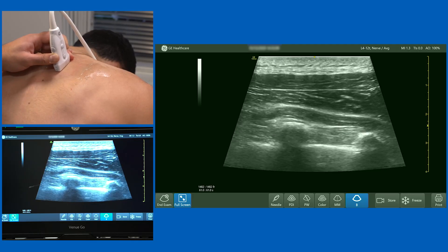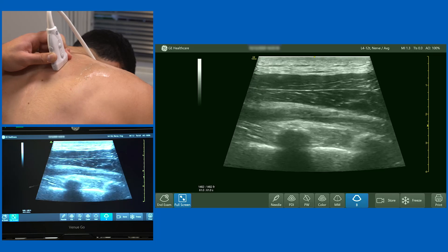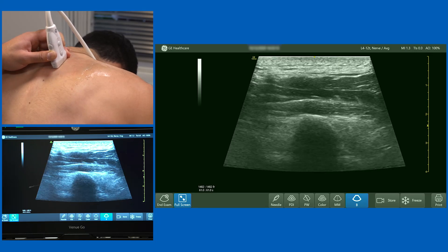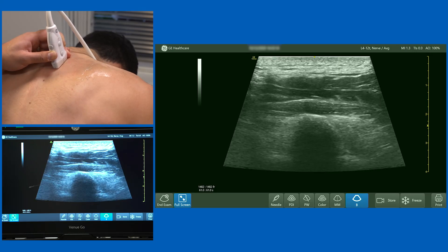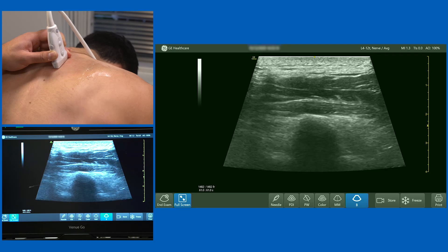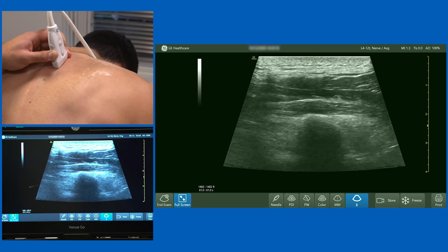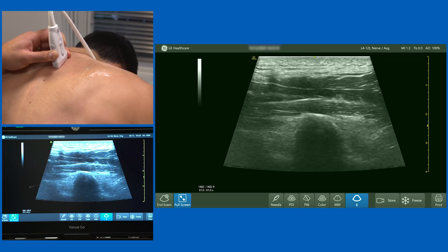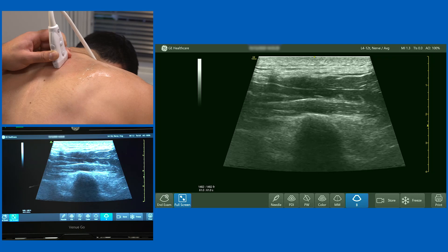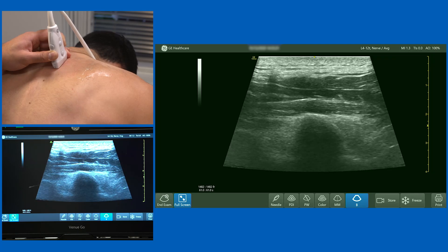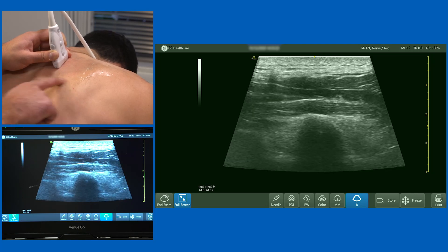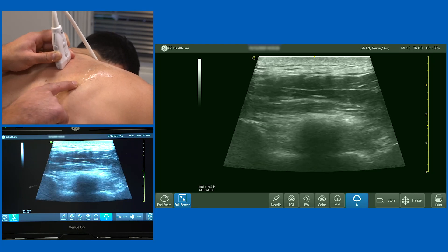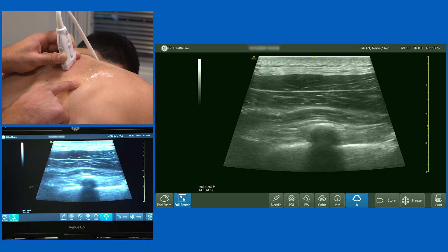A thick muscle is developing here, and you'll also notice that the bright white structure we call the rib has changed in its morphology. Right in the centre of the screen now, that is a transverse process. I'll show you that again — moving laterally, watch the transverse process and that bony outline as it changes.